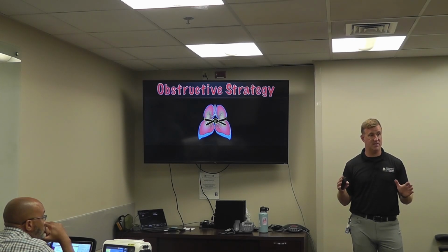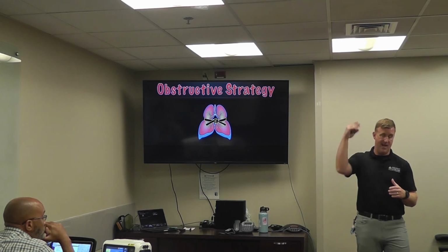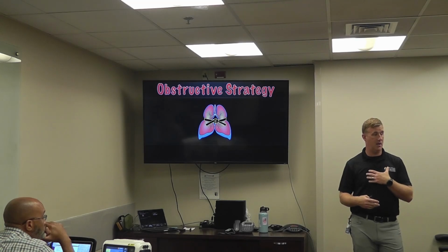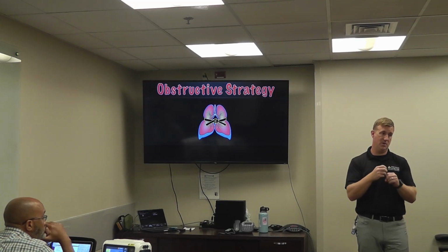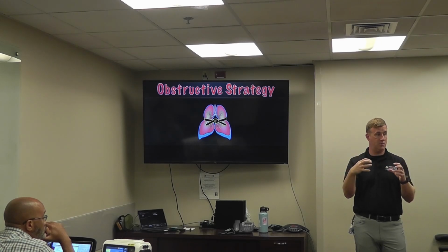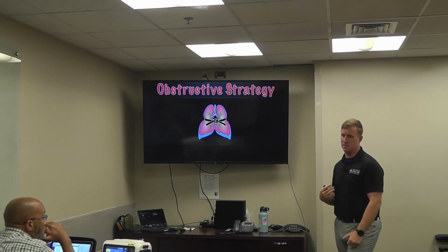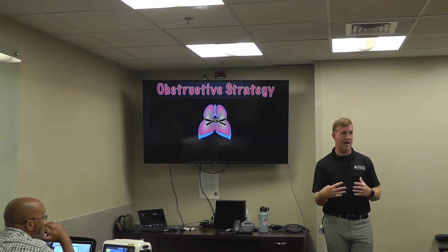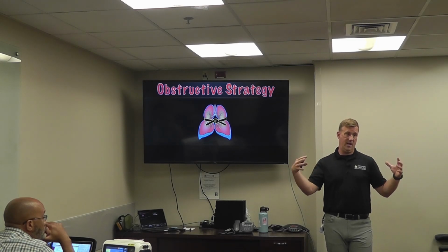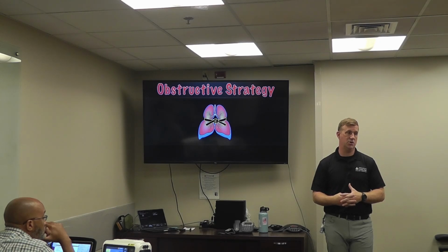Our asthma patient, the reason for that is essentially a ball valving action, right? I can get air in, whether I'm pulling it in, if I'm spontaneously breathing, or on the ventilator, I'm pushing it in. I can push it past that edema, expand that shrunken airway, but then it's going to ball valve behind that. It's going to trap that air, okay? Our emphysema patient, their problem is they have no elasticity in their lungs. Their lungs don't spring back. So I put air in and it stays in there. And then I put air in and it stays in there. And so they exhale very, very slowly.